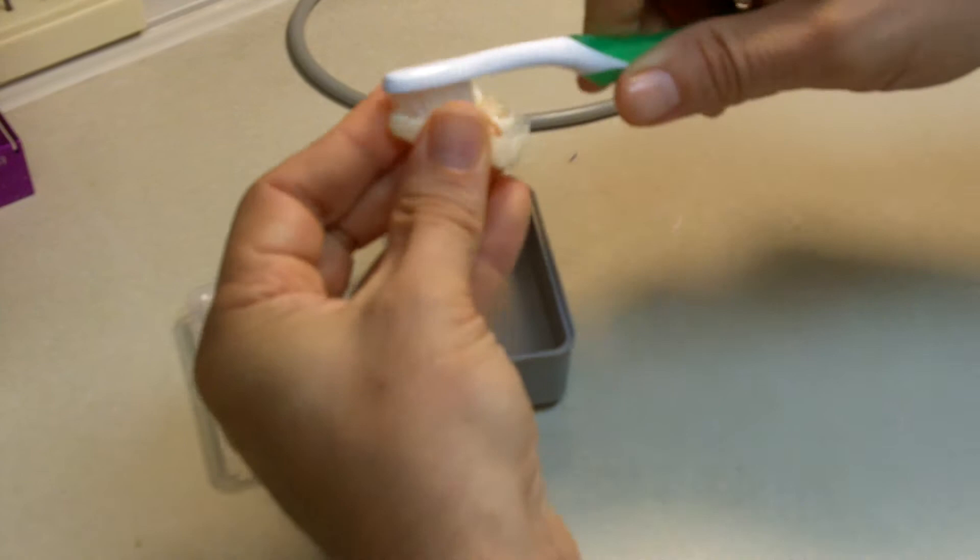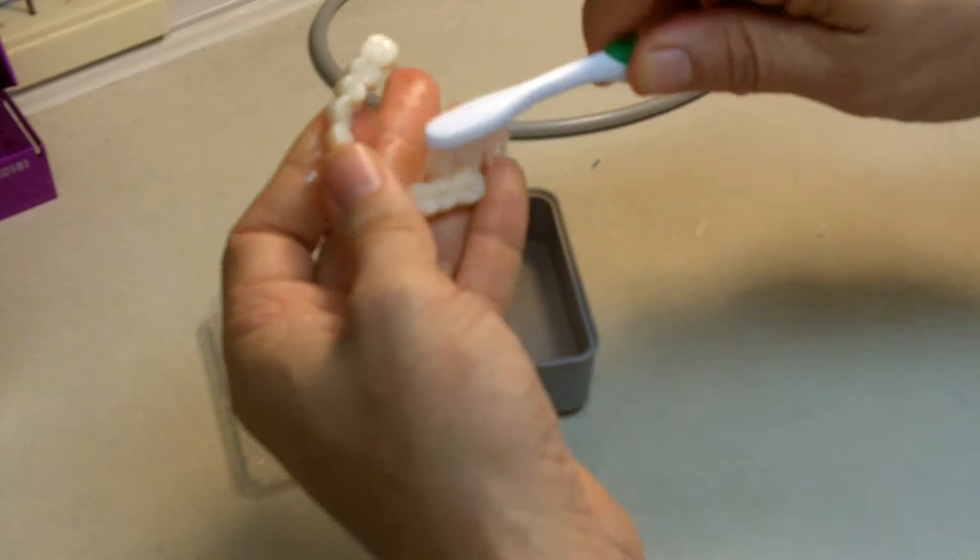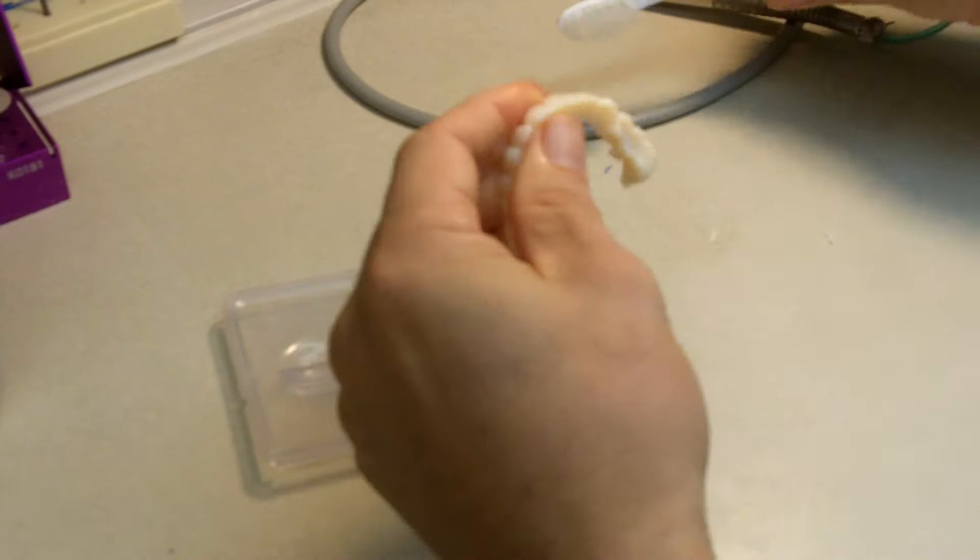The purpose of this is to remove the oxygen-inhibited layer on the provisional so that as I adjust it, I'm not dealing with that gunk on the outside that gets all up in your burrs. Now I'm going to dry this.